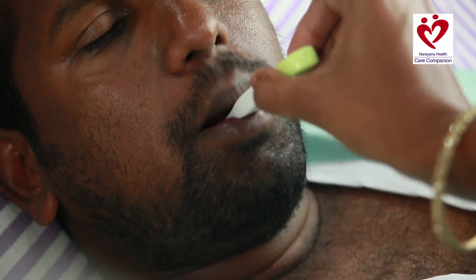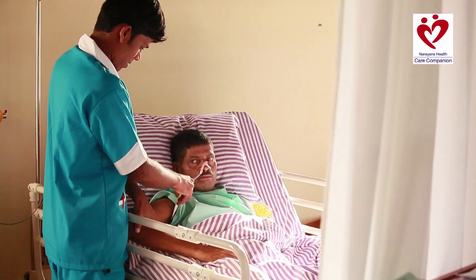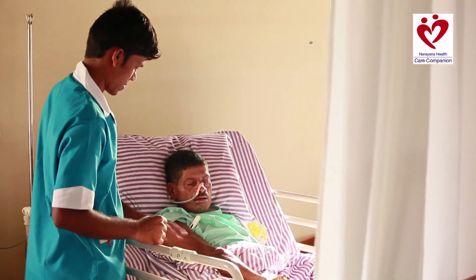Thirdly, you can either place the thermometer under the tongue or under the patient's armpit. You have to make sure the sensor is completely surrounded. Close the mouth or armpit and wait a few minutes for a beep or the temperature to be measured.